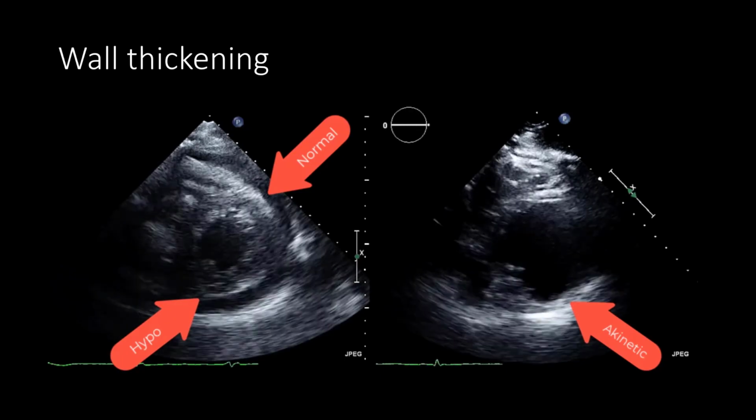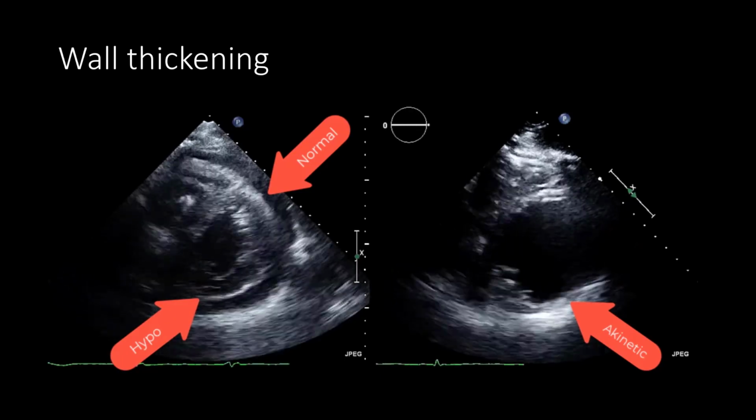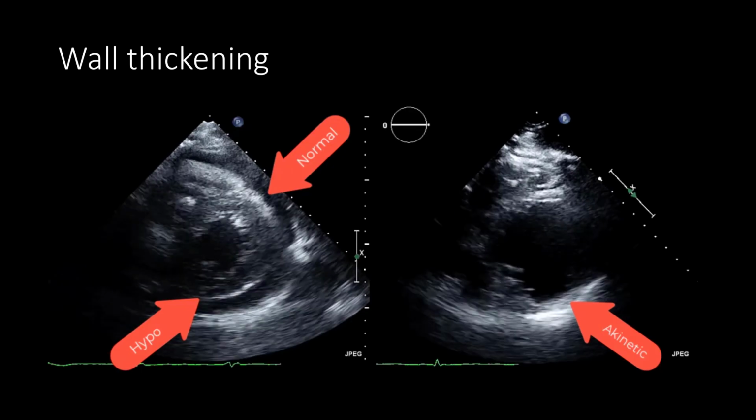With some experience, you will start noticing when something is thickening, but is not as springy as you usually see. These slight differences can help hint at a subnormal LVEF.